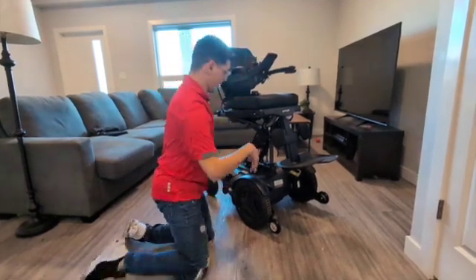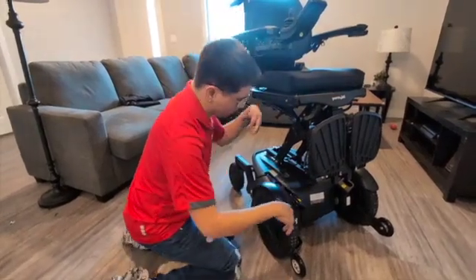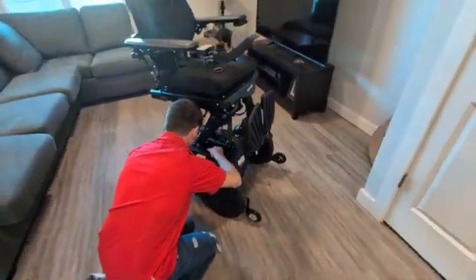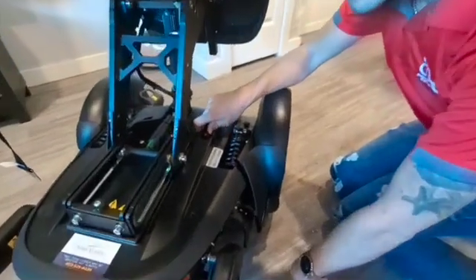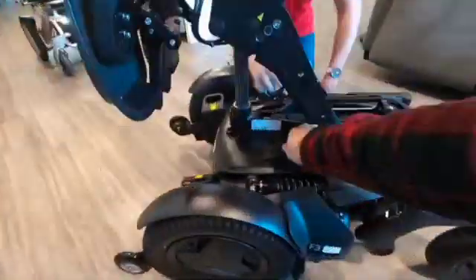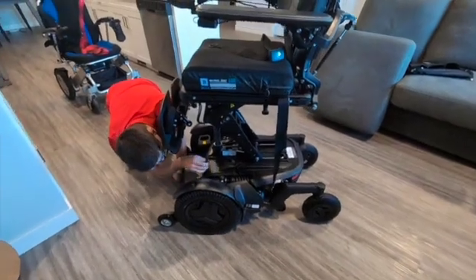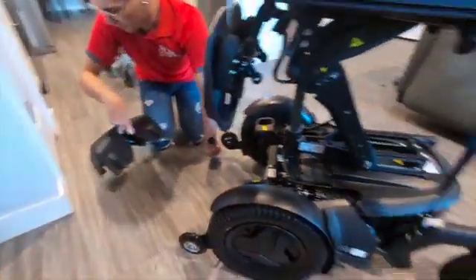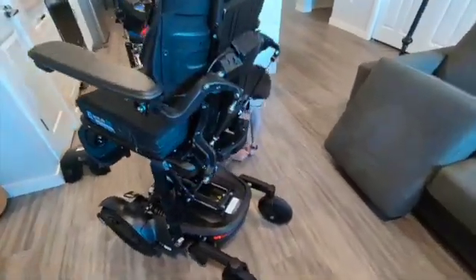Okay, power off. Put these up. This is my first time taking this chair apart, so I think all you do is loosen these thumb screws. There are front covers to slide off now. There we go. So it's going to be way easier to do properly with it taken apart.